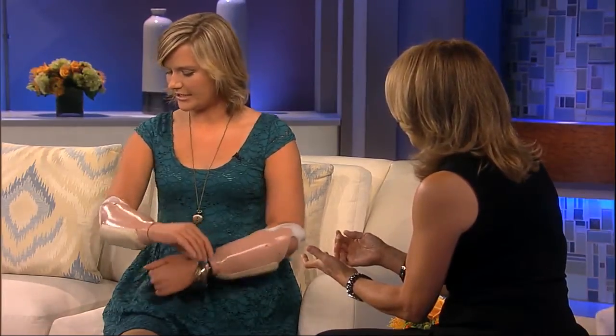First of all, you have bionic hands. Can you show us how they work, Amy? Absolutely, so the hands are really cool. They've actually got two electrodes. You can kind of see two holes on either side of my arms — that's where the electrodes are.